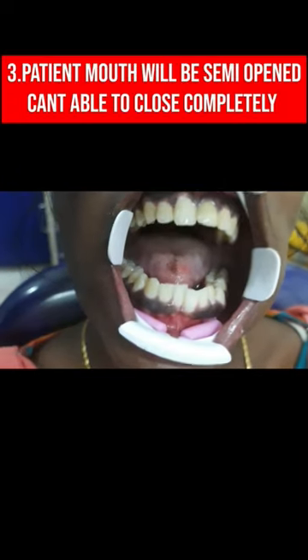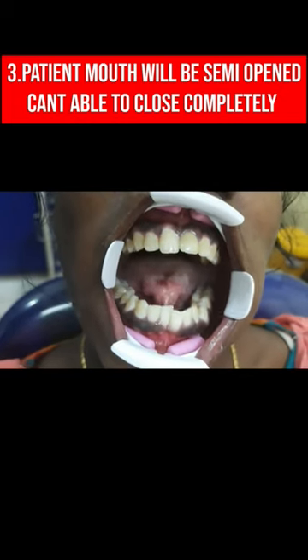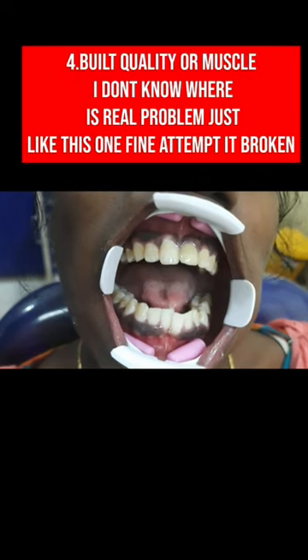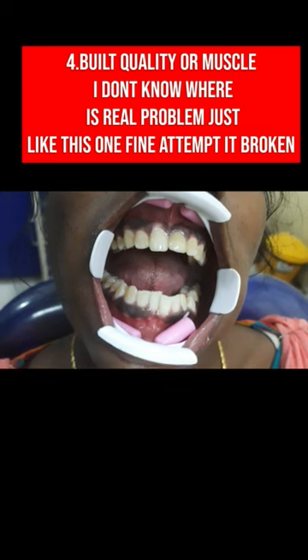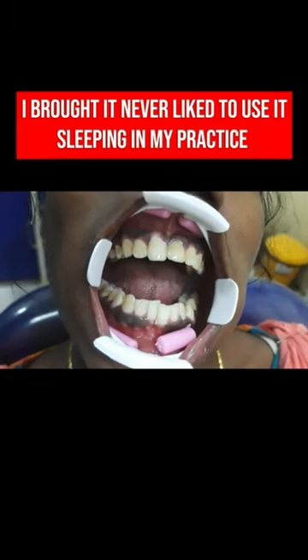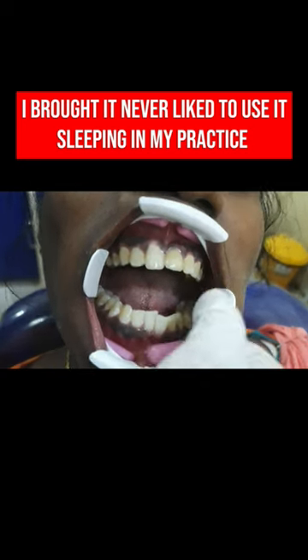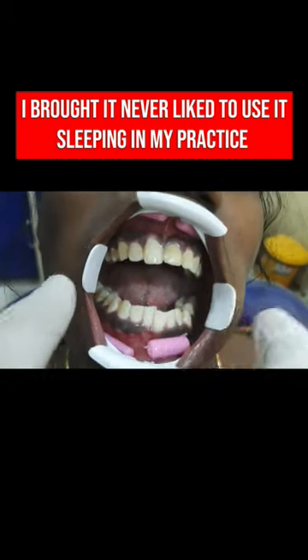Third problem: you can see the patient's mouth has been opened semi-open and can't close completely. The rubber block displaces due to excess lip muscle activity — or it may be a build quality issue. It has been broken just like this one. I bought it one day and never liked to use it again in my practice. I am not a big fan of this 3D cheek retractor.